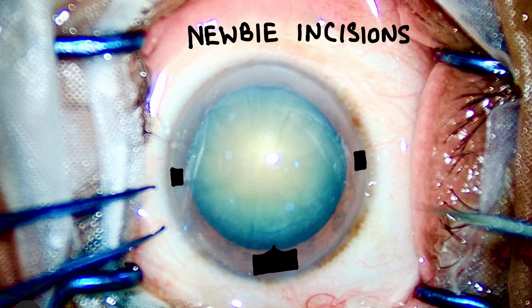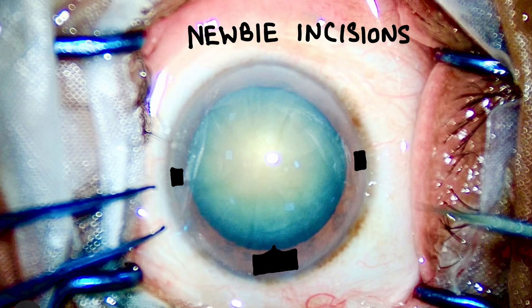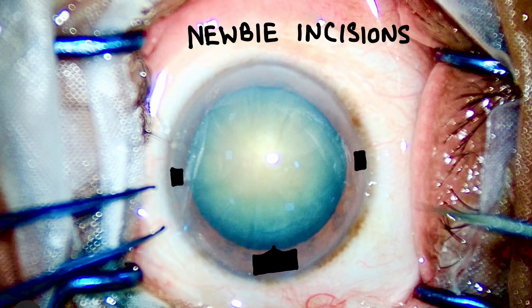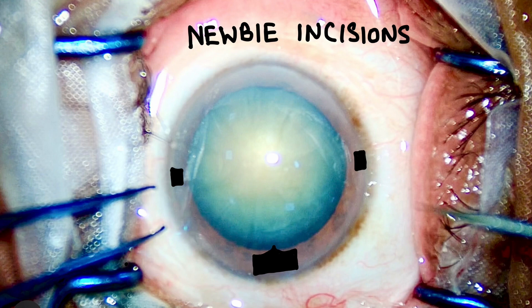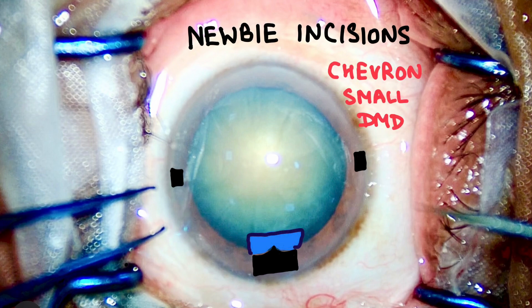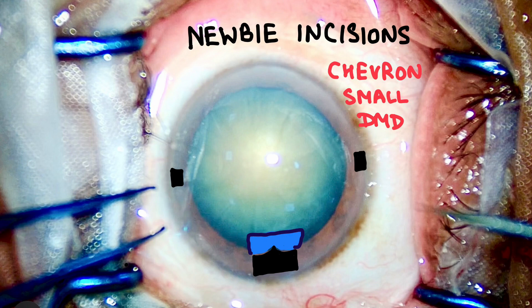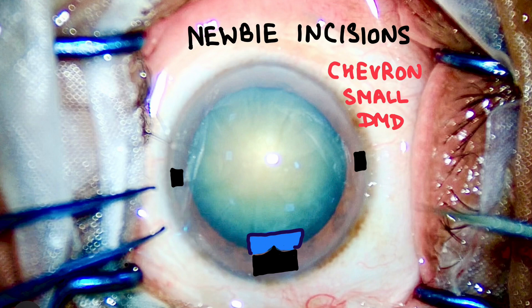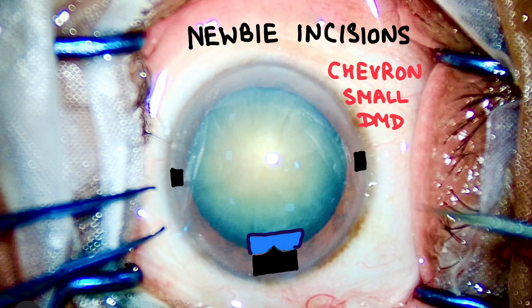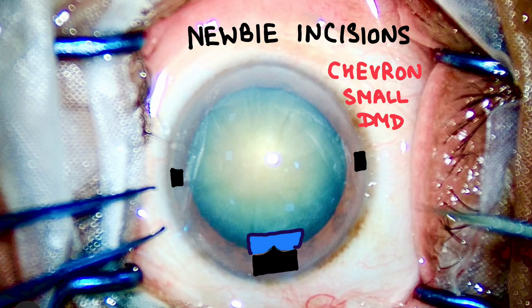The fifth mistake is a chevron incision. Once a new surgeon learns to make a biplanar or triplanar incision, they may not know when to switch the main port parallel to the iris plane, and by mistake you will have made a chevron incision. The side effect of a chevron incision is that it also leads to a small DMD. A small DMD is very common in chevron incisions. I have done all these mistakes in my career and I don't want you to make the same mistakes — that's why I love to make educational content. I would suggest all new surgeons to start making well-timed, perfect biplanar or triplanar incisions.